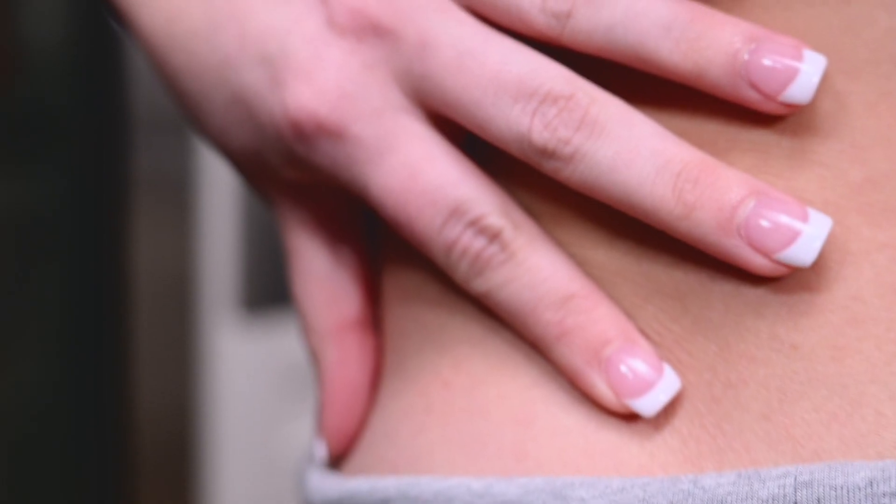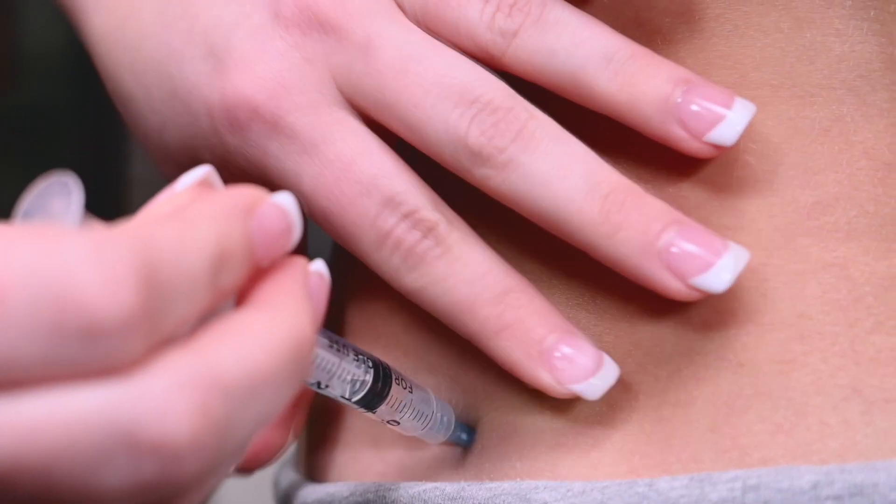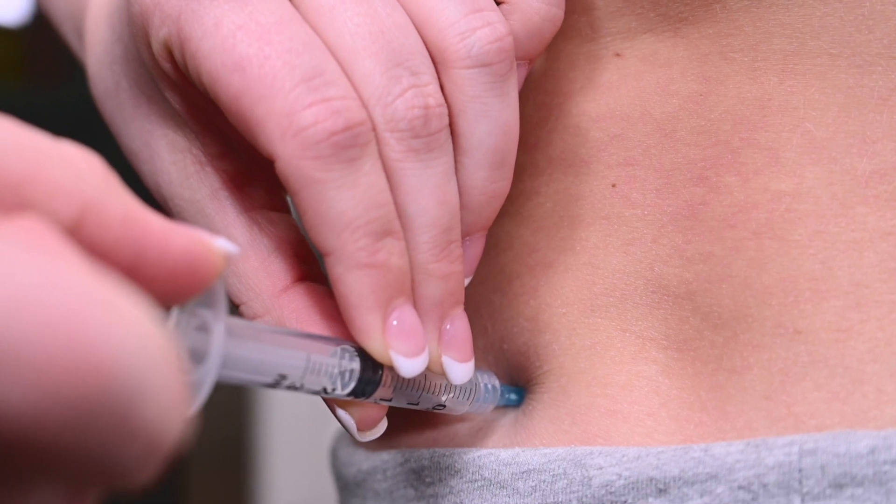Take the syringe in your preferred hand. Stretch the skin between your fingers at the injection site and insert the injection straight into the skin. Pull back slightly on the plunger. If no blood enters the syringe, proceed with the injection. If blood does enter the syringe, remove the needle and reinsert in a nearby cleaned injection site.